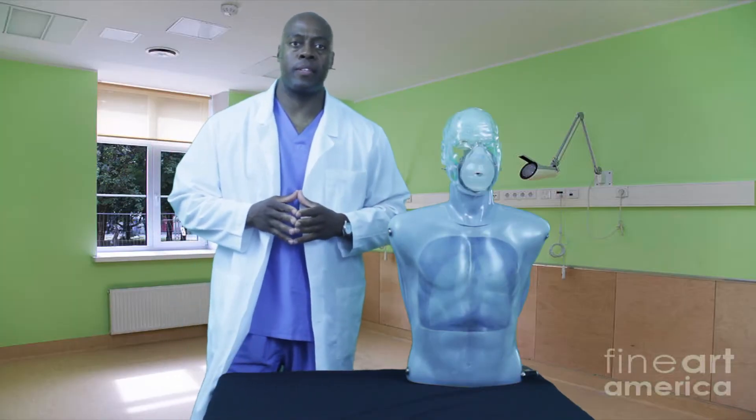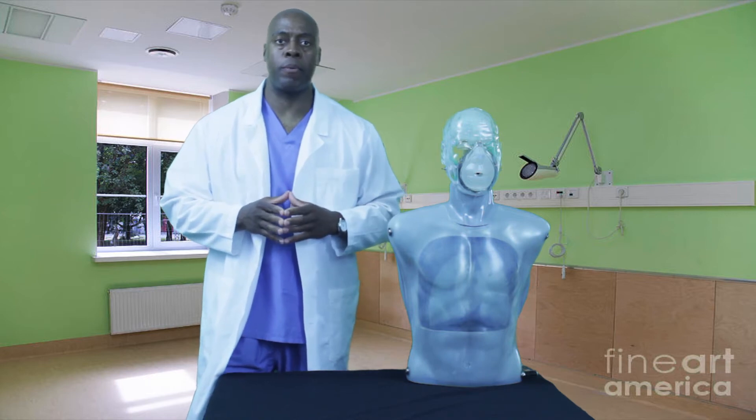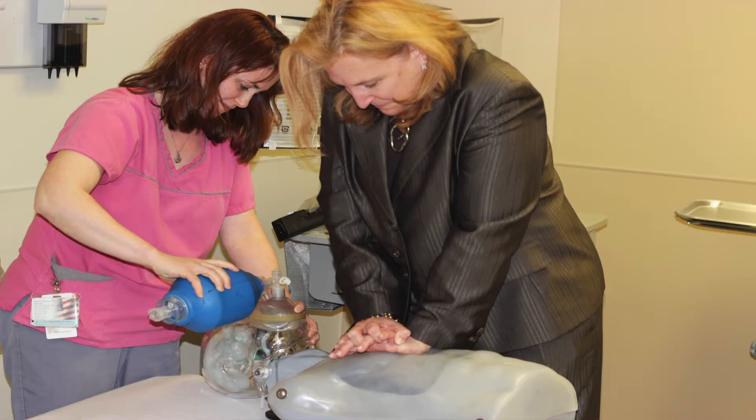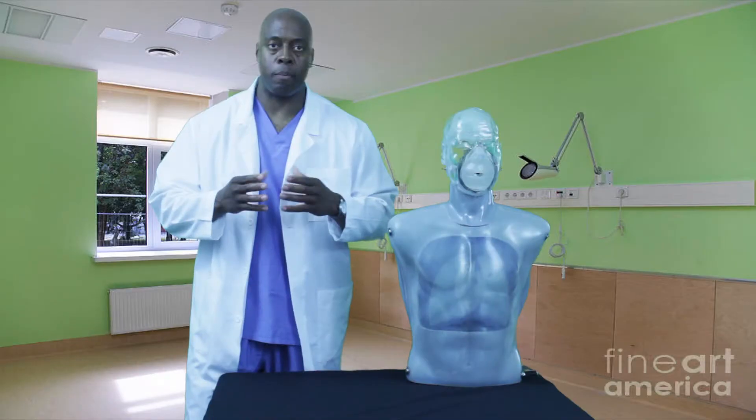I wanted to provide a training device that gives clear and immediate feedback when CPR is performed. I also thought it was very important to provide a robust chest mechanism capable of withstanding a high amount of force, so the person in training can learn how to apply the correct amount of force to the weight and size of a body.